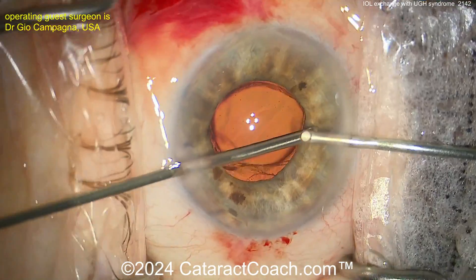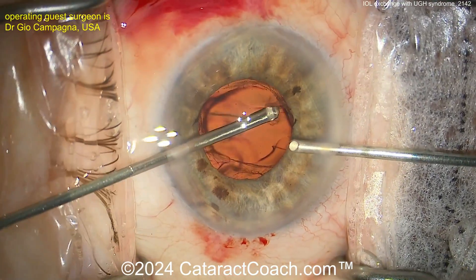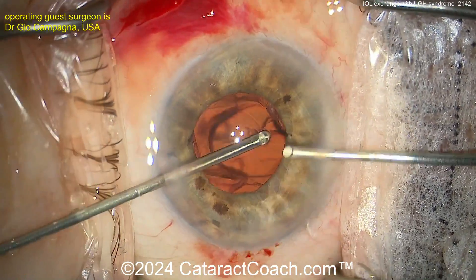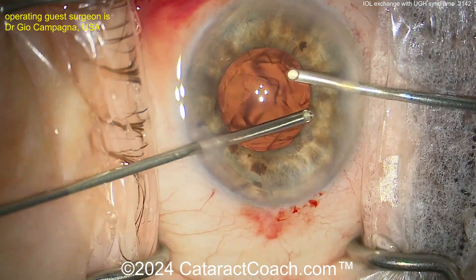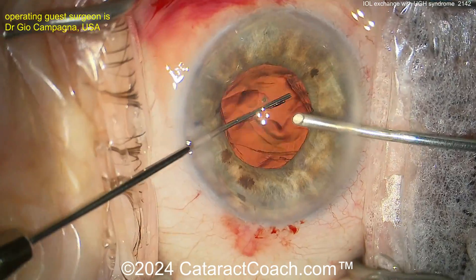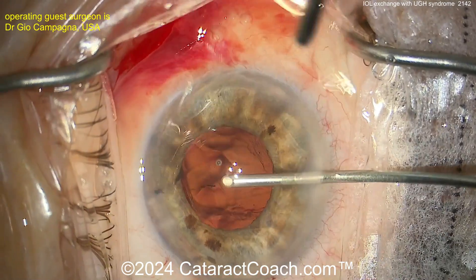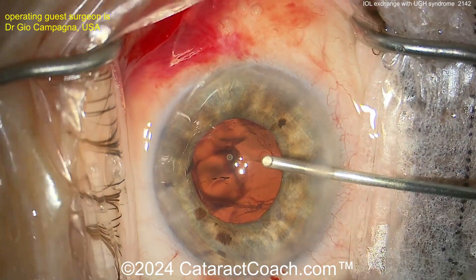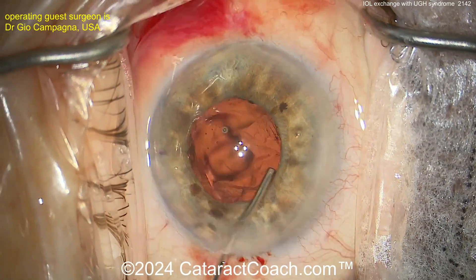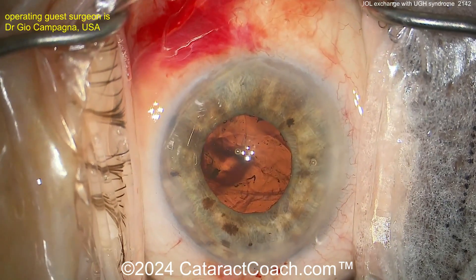Cleaning up here now. A little more anterior vitrectomy in the anterior part of the eye. Being very careful with that vitrector — do not damage the iris. That vitrector can chew through an iris like no one's business, so you want to avoid that. Now just looking around to see what your level of capsular support is, because you need to get the new lens in the eye. A little bit of viscoelastic, probably opening up that sulcus.